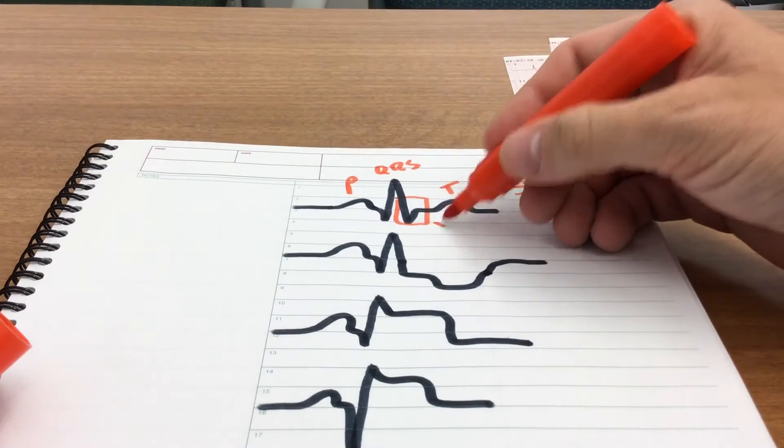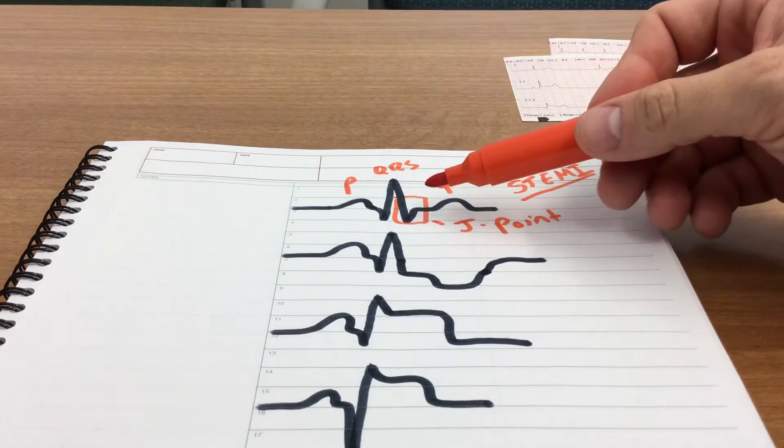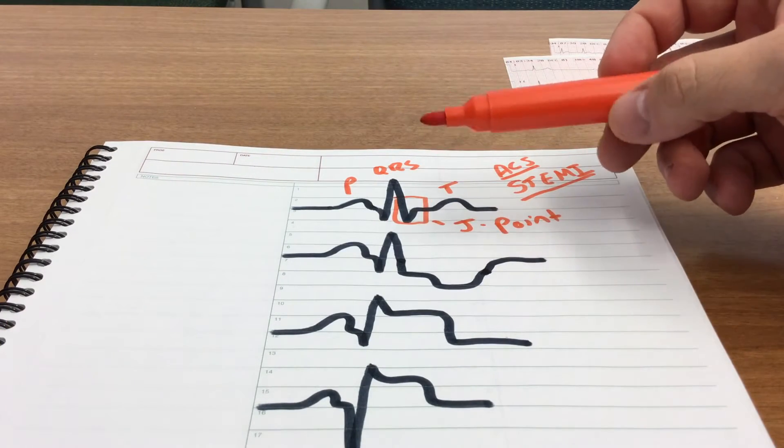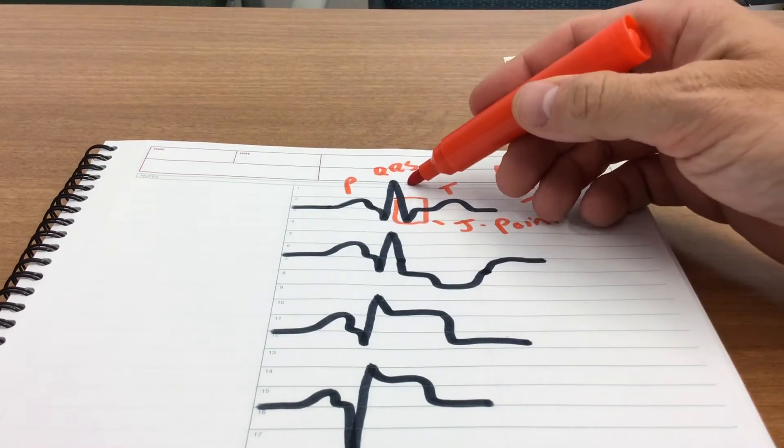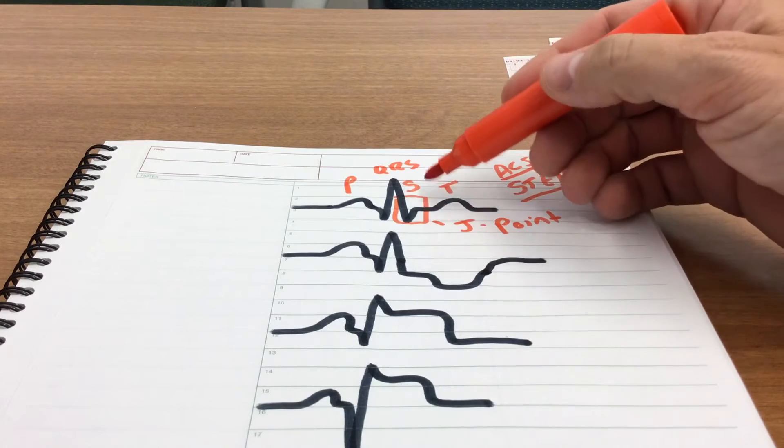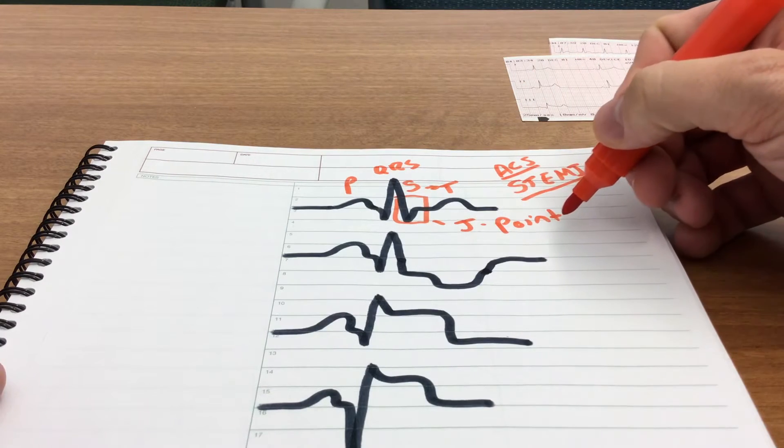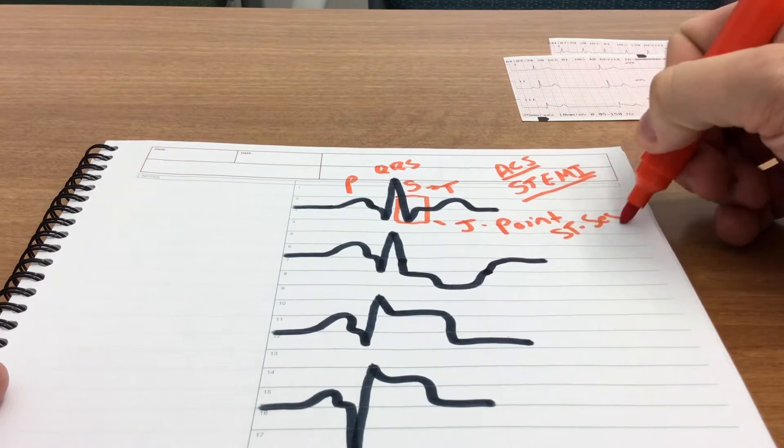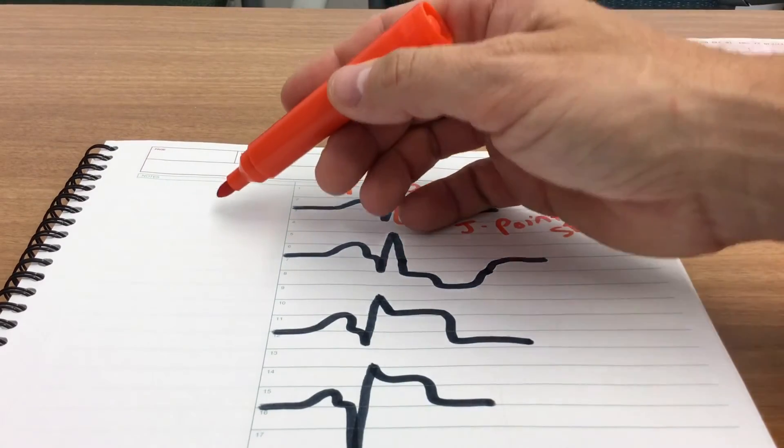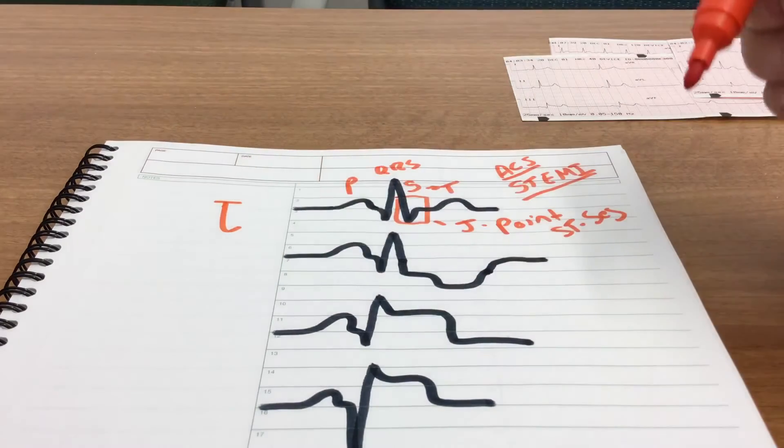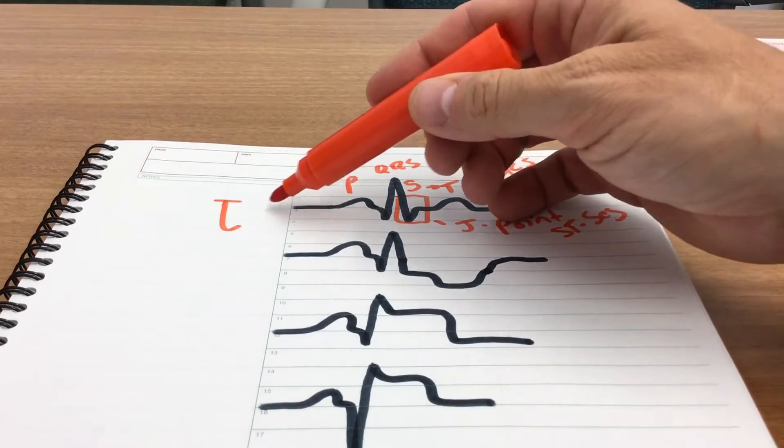This is known as the J point, and that's where we start our basic analysis if we're looking for ST segment abnormalities. The J point is where our S wave terminates and we transition into the T wave. This is also known as the ST segment. If you look at the J point, it does kind of resemble a J, right, just like that.